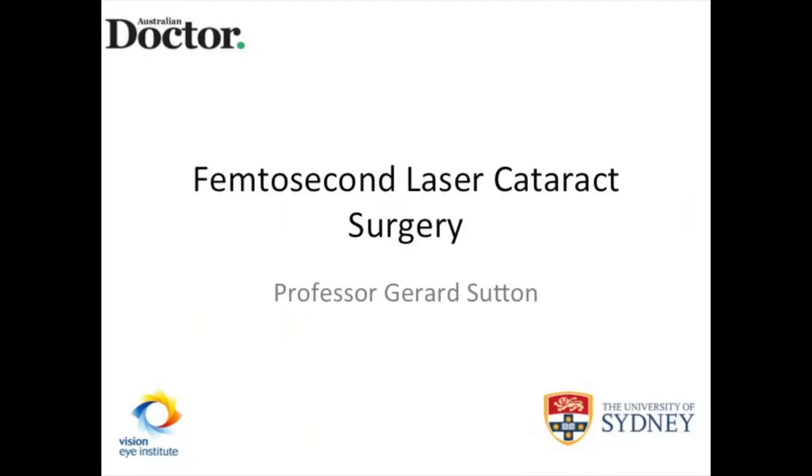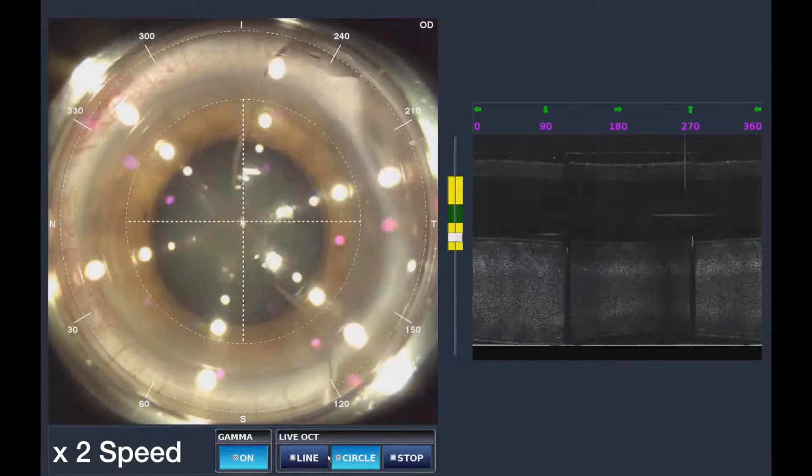This is Gerrit Sutton. I'm just going to talk you through a standard cataract operation. My standard technique involves the use of the femtosecond laser, which does two things.